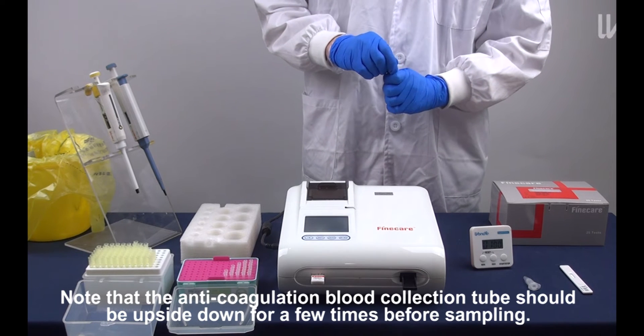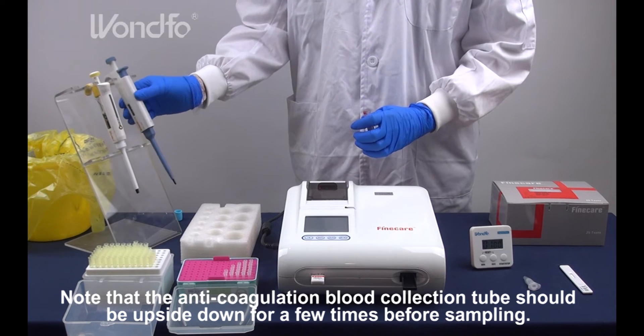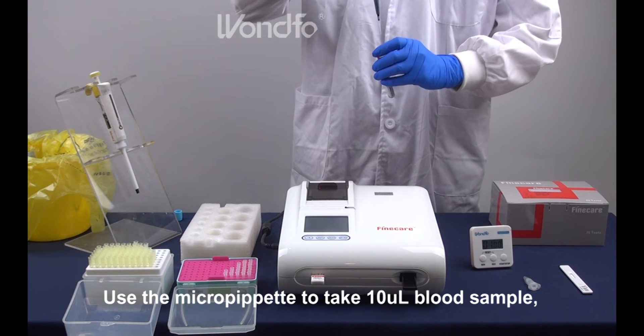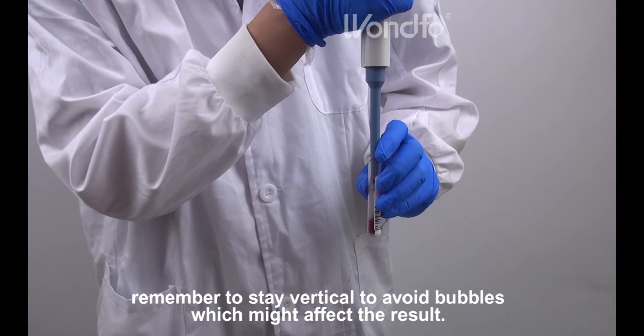Note that the anticoagulation blood collection tube should be turned upside down a few times before sampling. Use the micropipette to take 10 µL blood sample. Remember to stay vertical to avoid bubbles which might affect the result.